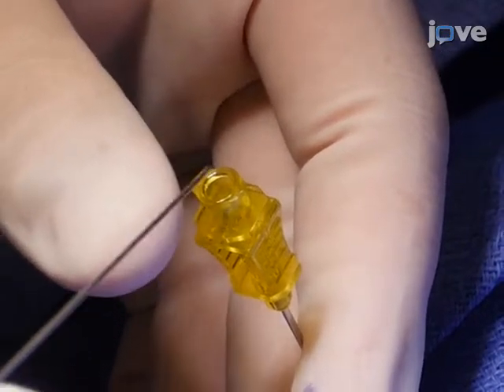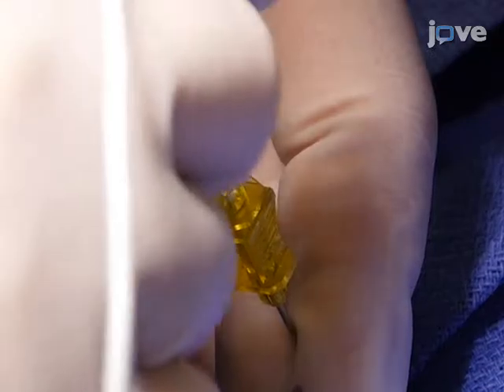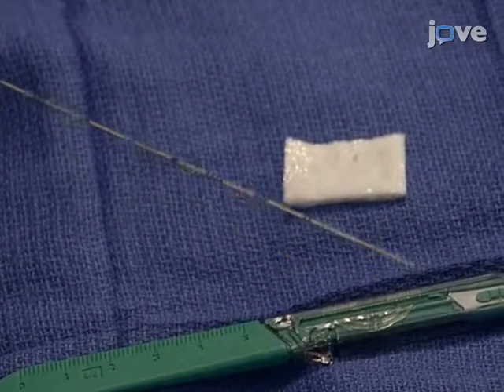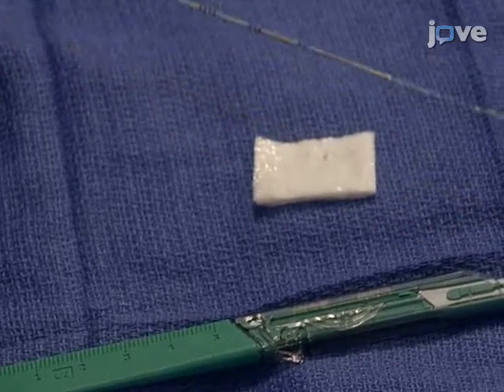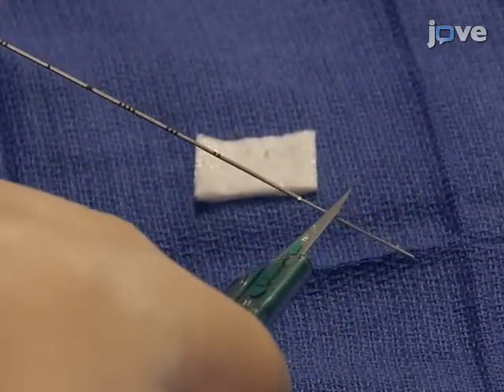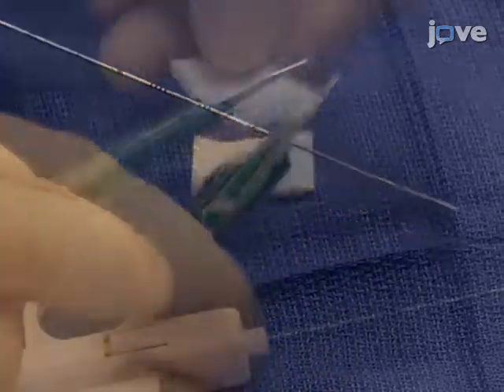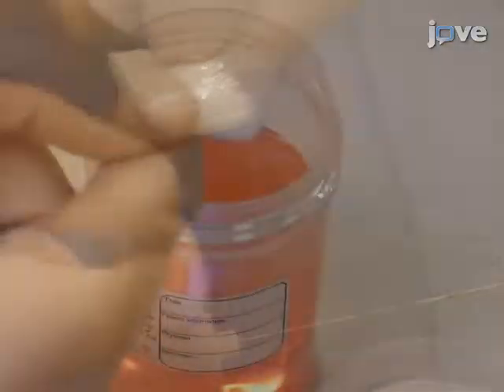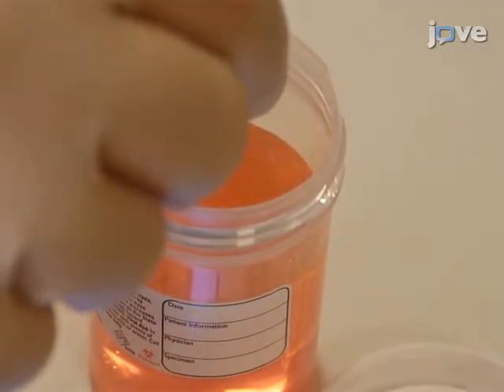Now, gently advance the guidance probe back into the lumen of the percutaneous needle and keep it stable. With the needle continuously stabilized, have an assistant use the scalpel blade to gently remove the specimen from the inner cannula of the core biopsy needle and place it on a 1/2 by 1/2 inch non-adherent pad. Then immerse the pad in formalin solution.